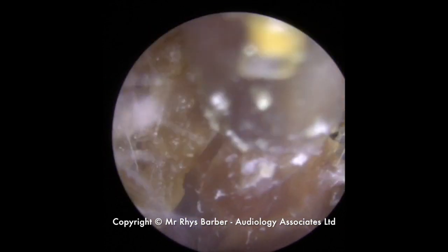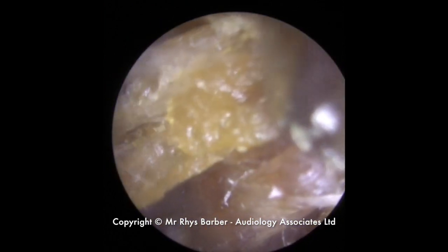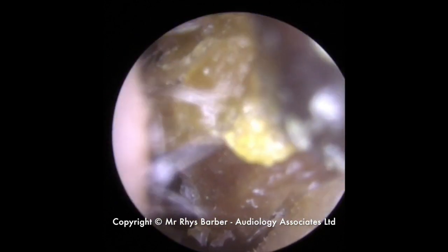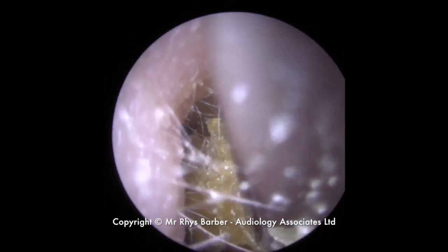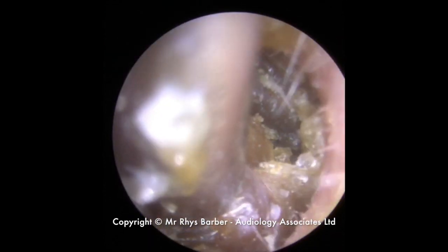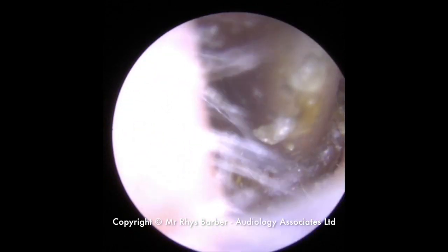So you can see we're just really rocking it back and forth, trying to detach it from the canal wall. It's kind of wrestling me a little bit here — as I'm pulling it out, it's holding in. So it's just trying to get as much of a grip as you can, pulling it and wiggling it back and forth, maneuvering it out a little bit more. Just starting to see it maneuvering out of the canal now. I don't think it's going to come out in one piece — it's going to break. So we're just going to go in now and get the next section. You can see it's all moving — if you look just past the suction tube, you can see the whole lot moving in that canal.